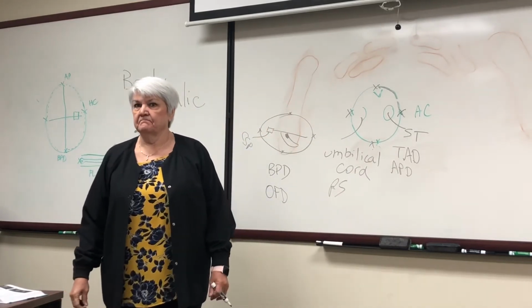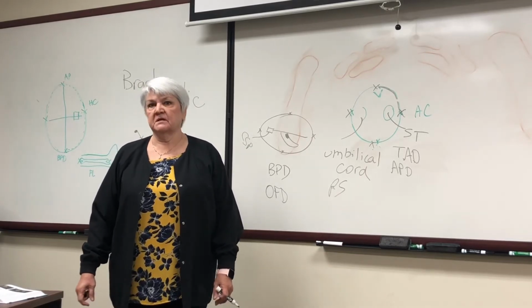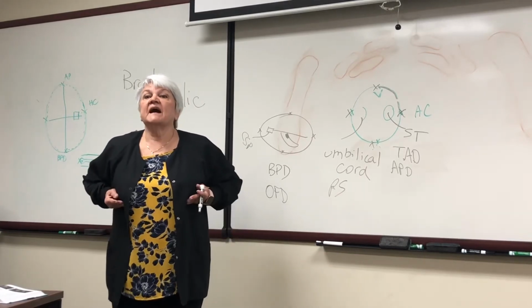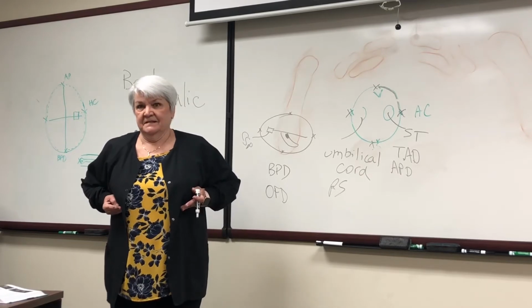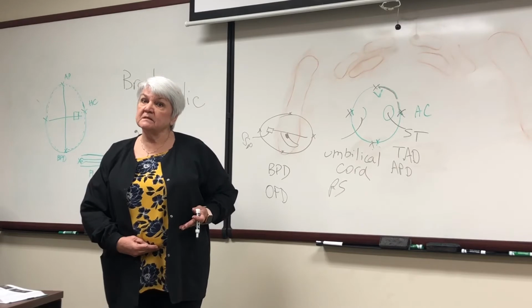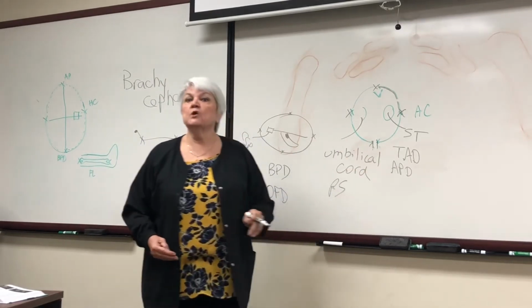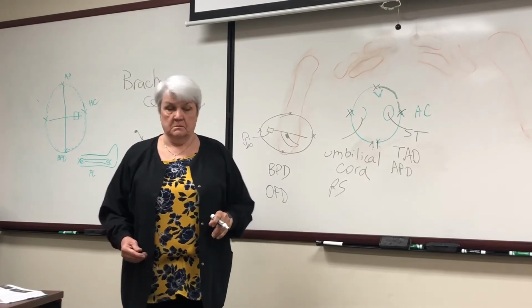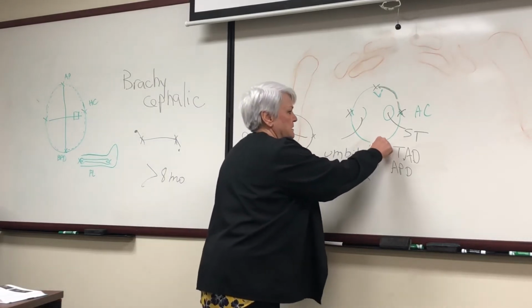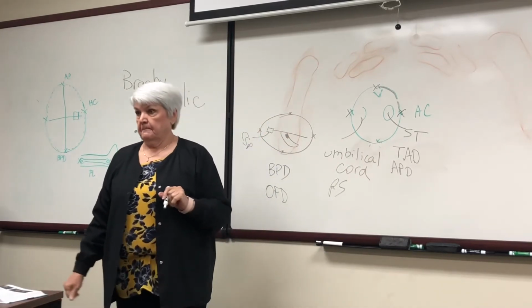Okay? What about the base of the heart? You don't want to get that high or to diaphragm? No, you don't want to see, because the heart's even higher than the kidneys. So you don't want to have the umbilicus. You don't want to have the umbilicus. You're too low. Okay? You want it to be clear. Okay?